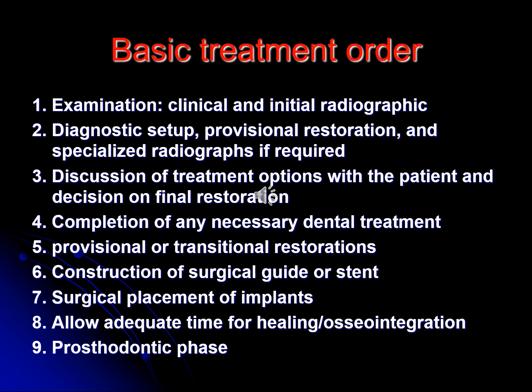After that, we will prepare the provisional or transitional restoration to be ready before implant placement, to use this provisional restoration directly after implant placement. Later, we will change the provisional restoration into a radiographic stent to help us during our radiographic assessment of the case and decision of the number of the implants and the distribution of the implants.